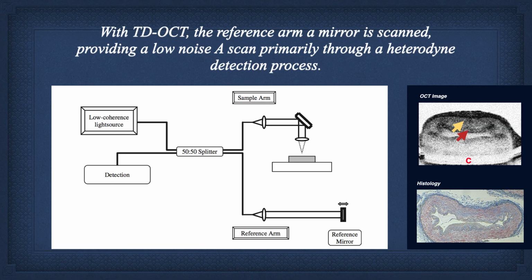Now, we run into a problem, and this is the big challenge with time domain OCT. There's a limit, which is pretty slow, on how much you can move a mirror back and forth. You can calculate this out, the weight of a mirror, the things you can use to move the mirror. You're not going to image more than a frame per second.